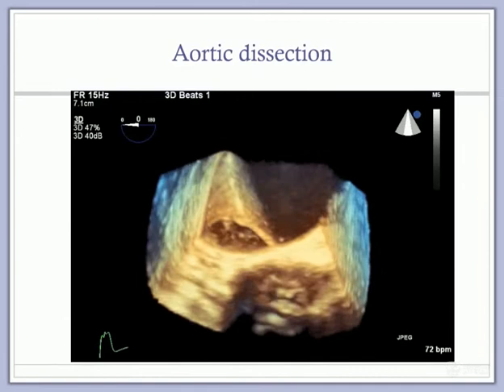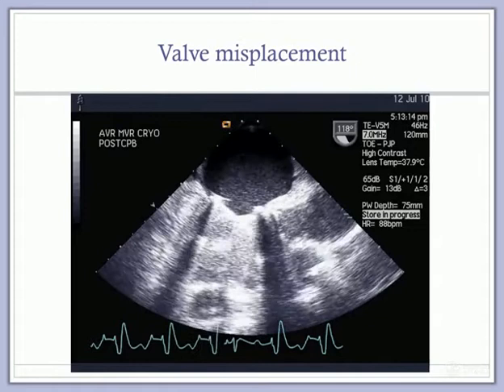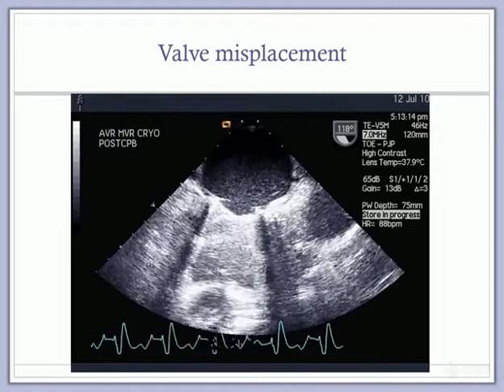So this is an example of an MVR, but I wanted to show it anyway because I suppose this could happen with an AVR. After a mitral replacement, we tried to come off bypass, but with the leaflets seemingly moving okay, there was no output. The surgeon and the anaesthetist both realised about the same time that the valve was opening in systole. The valve had been sewn in upside down.